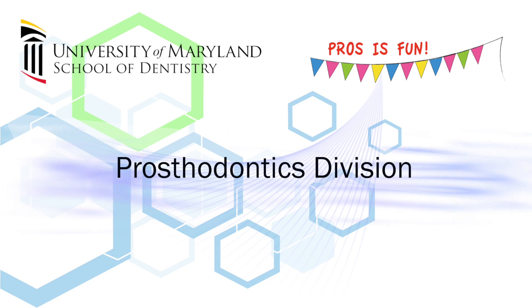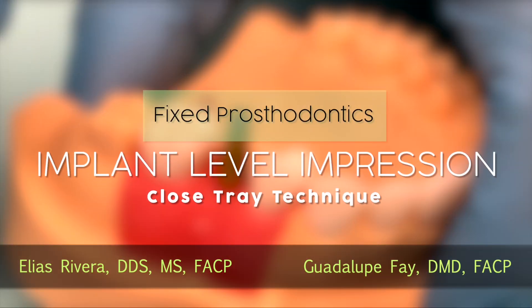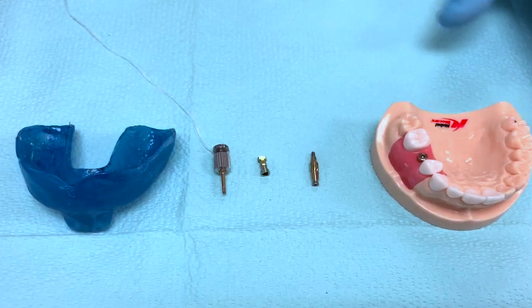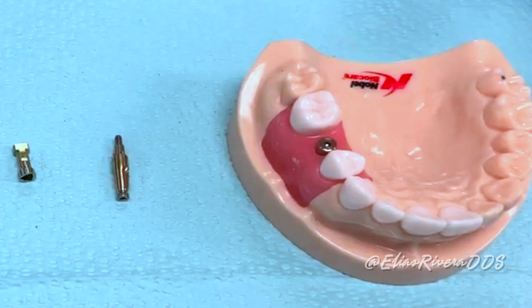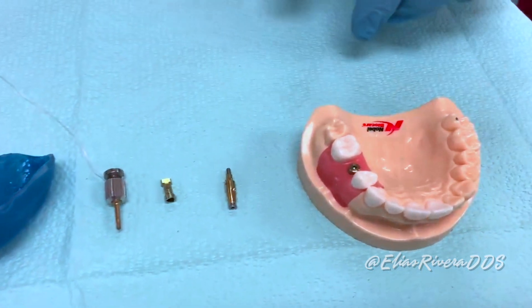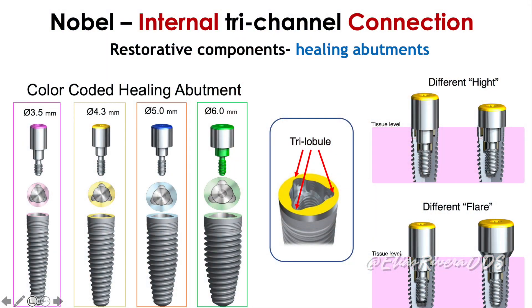Welcome to the channel. Today we're going to talk about the closed-tray implant impression technique. Here on the table we have the parts we're going to need for this exercise. We have our simulated patient that has been referred back from the surgical provider. This patient presents with a Nobel Biocare internal connection tri-channel implant.